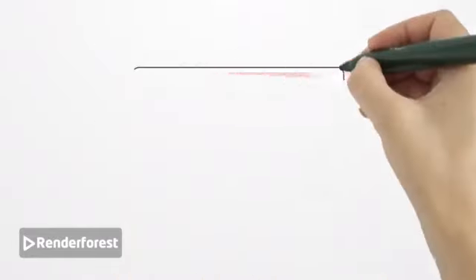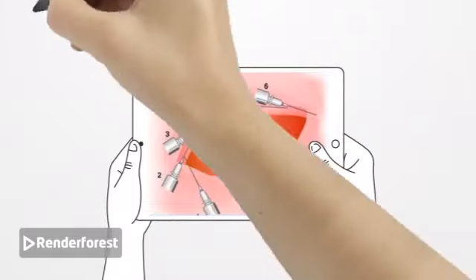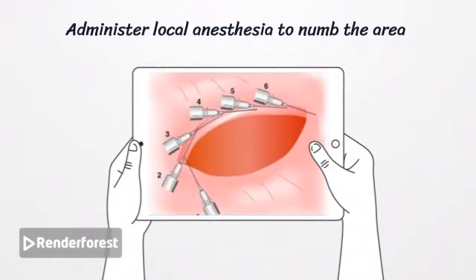Anesthesia is crucial to ensure the patient is comfortable during the procedure. Lidocaine or another local anesthetic is injected around the wound site.